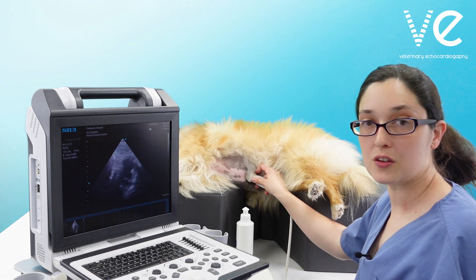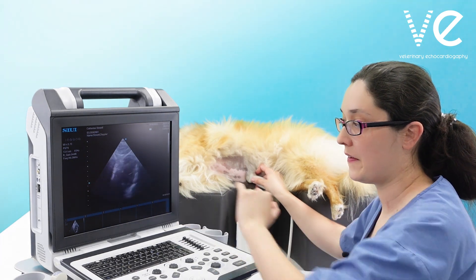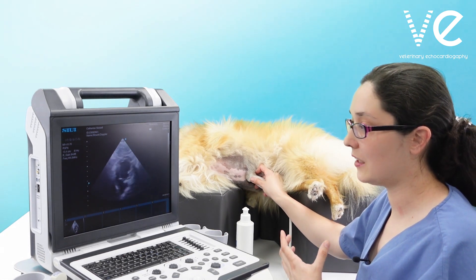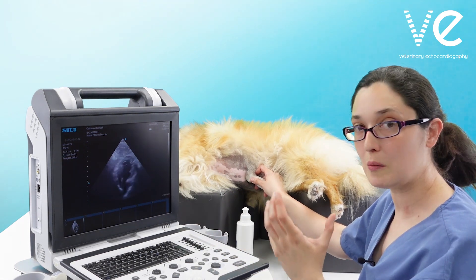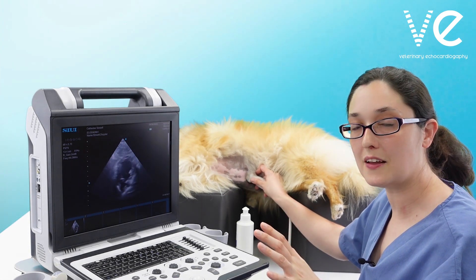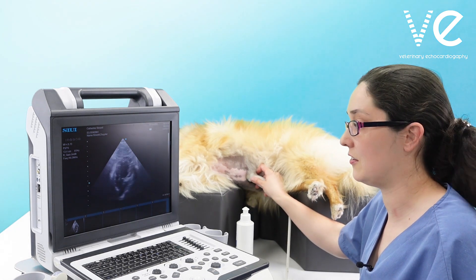The views on this dog are not amazing but they're certainly a lot better than you get in most patients. In some patients you'll only see that bright white line of the aortic valve, and in some you actually won't see anything at all. But the alignment from this view is so perfect that you could almost do this completely blind. It's worth just putting that continuous wave Doppler on, adjusting your hand position slightly — you might get a trace anyway.